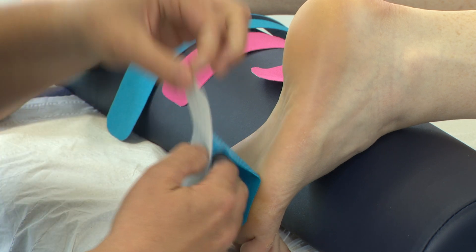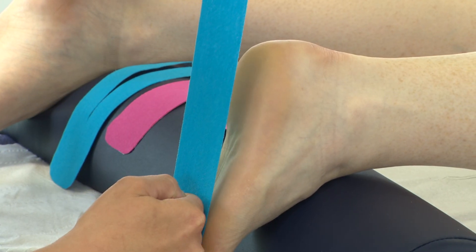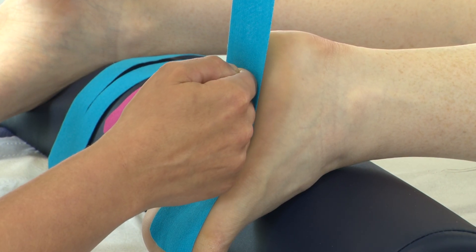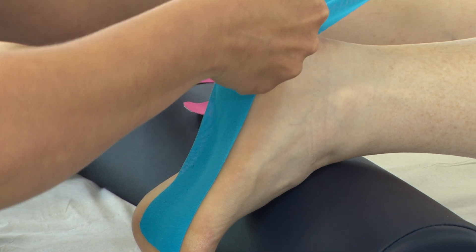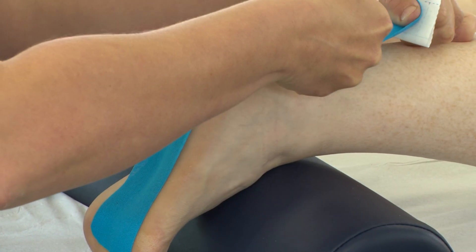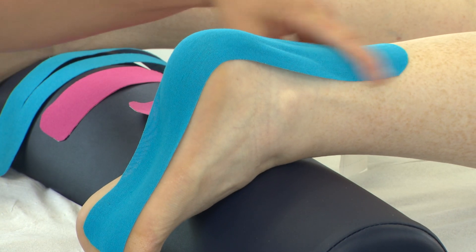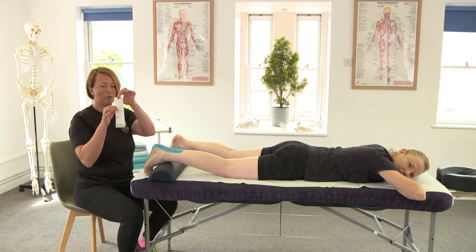In this taping technique we're going to go up straight at the middle of the plantar fascia, popping about 25% stretch on as the foot is already stretched, and then we're going to add 50%, so we're going to have 75% stretch around the calcaneus onto the Achilles and up to the lower part of the soleus. Again, no stretch on the top anchor — around about a square's length.